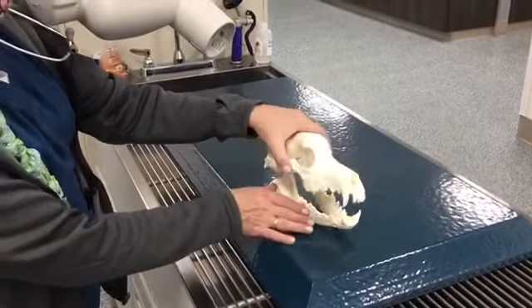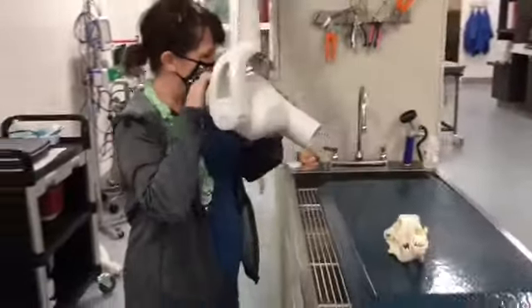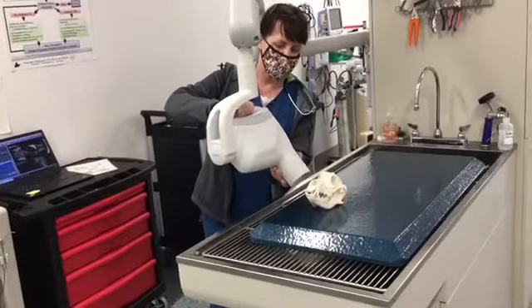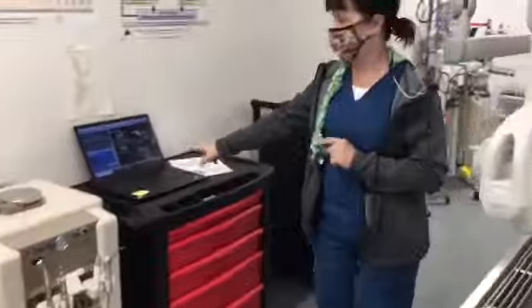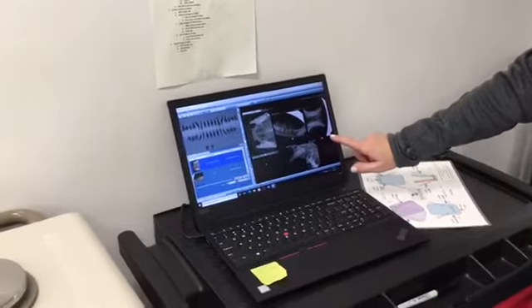We use this for practicing how to take good radiographs, and then we actually would do this on a real patient. So this little apparatus here is what we would use to take the picture, and we take a picture of that, and then it pops up here over on our computer. And I have pictures here. This is of a cat. This is my cat's teeth.